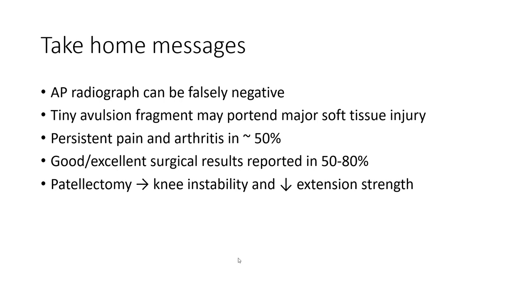Take-home message: AP radiography can be falsely negative. A tiny avulsion fragment may represent major soft tissue injury. Persistent pain and arthritis happen in 50%. Good to excellent surgical results are reported in 50 to 80%.